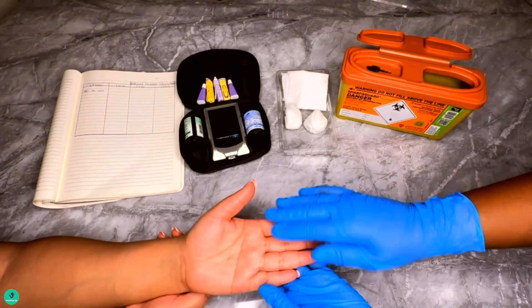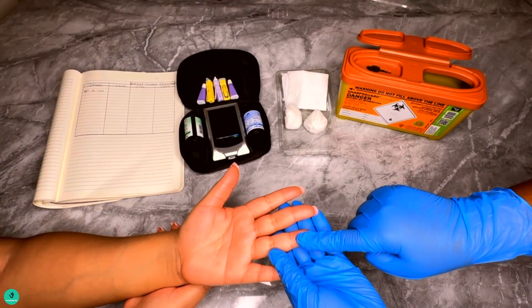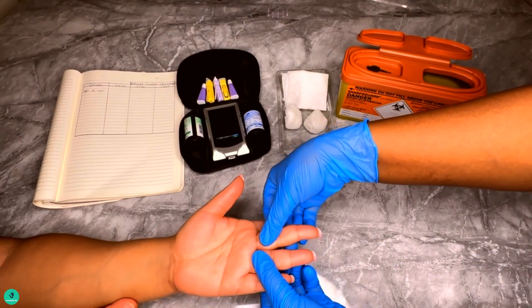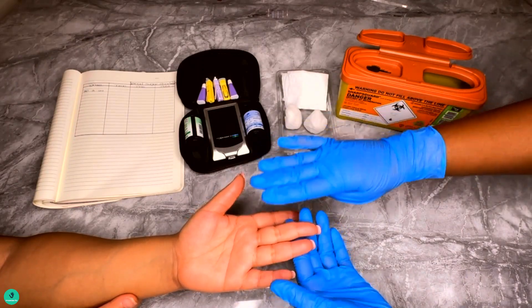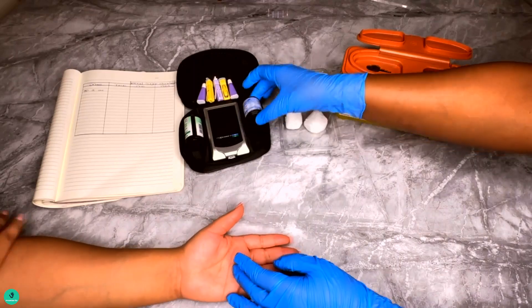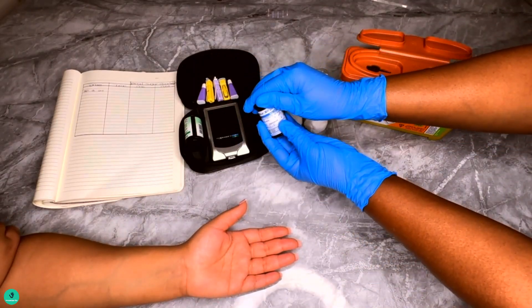Number two: maintain hand hygiene — that is, wash and dry your hands. This is to ensure that the results are not influenced by any food or other substance that may be present on your fingers.